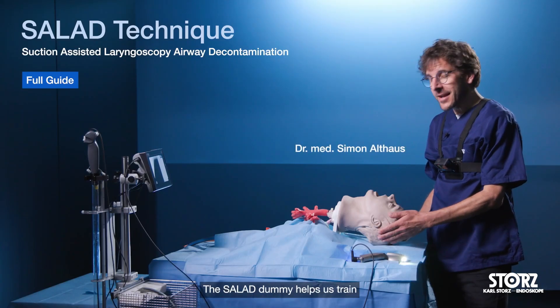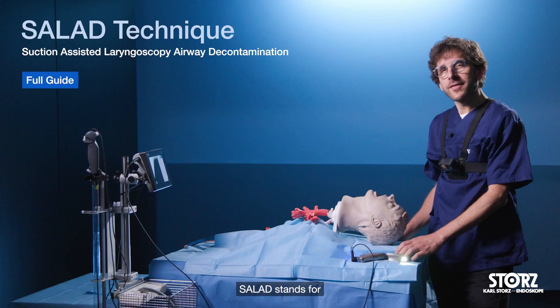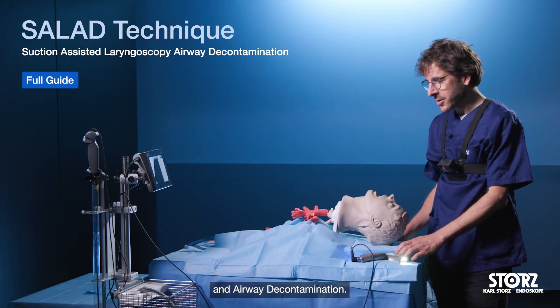Hi, I'm Simon. The SALAD dummy helps us train the management of a soiled airway. SALAD stands for Suction Assisted Laryngoscopy and Airway Decontamination.